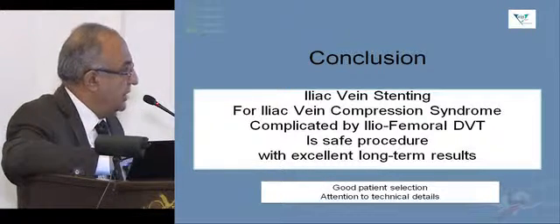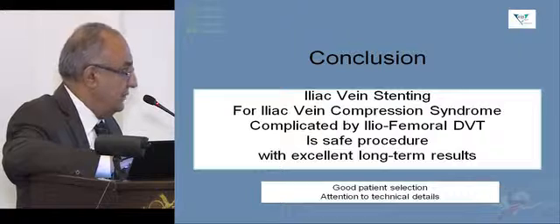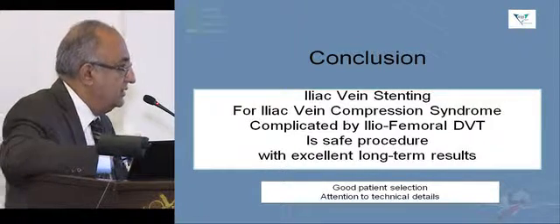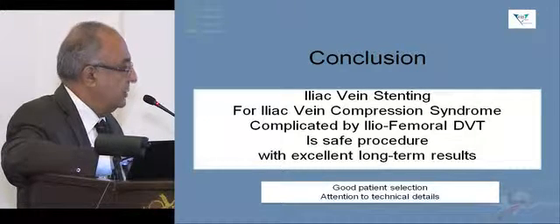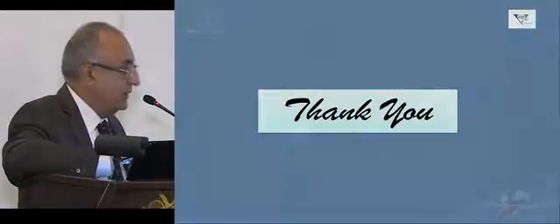In conclusion, Mr. Chairman, iliac vein stenting for iliac vein compression syndrome complicated by acute iliofemoral DVT is a safe procedure with excellent long-term results, given good patient selection and attention to minor technical details.